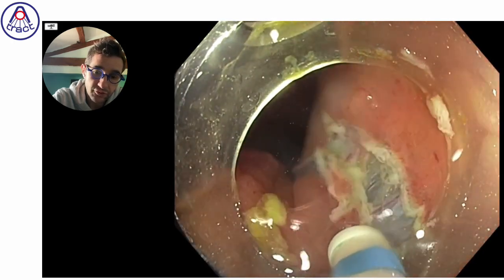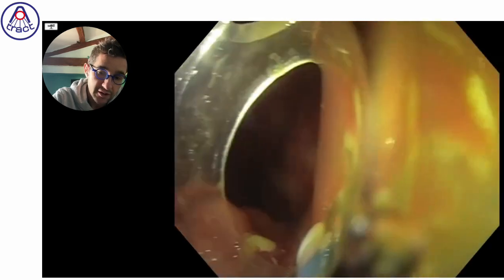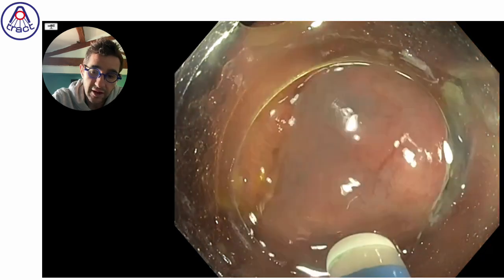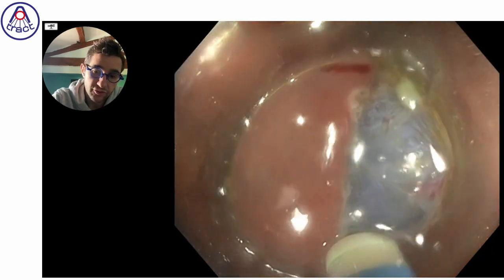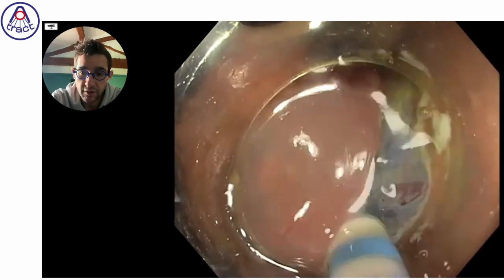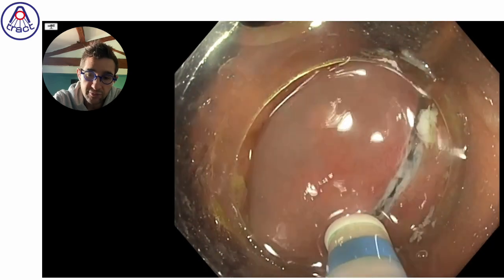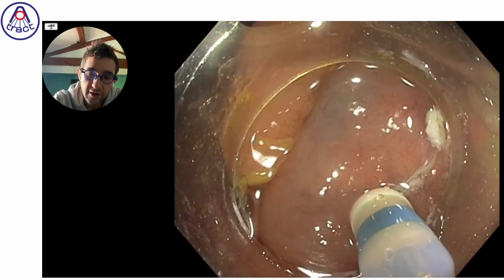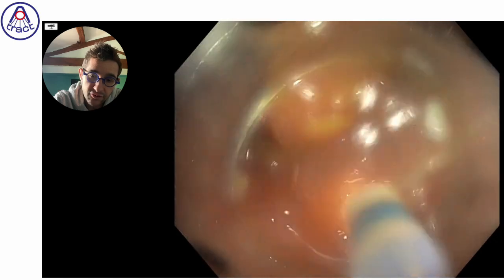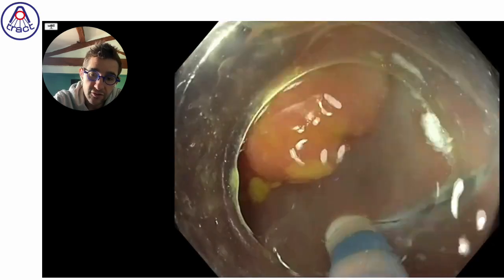And we could do first incision and complete this incision with a trimming in order to open the space and reduce the risk of having a movement of the lesion through the valvula, which is an area more difficult to deal with if the lesion enters into the small bowel. So here there is a large margin between the lesion and the valvula, but nevertheless it's probably better to begin by this difficult, challenging area instead of doing first the easy and later the more difficult.